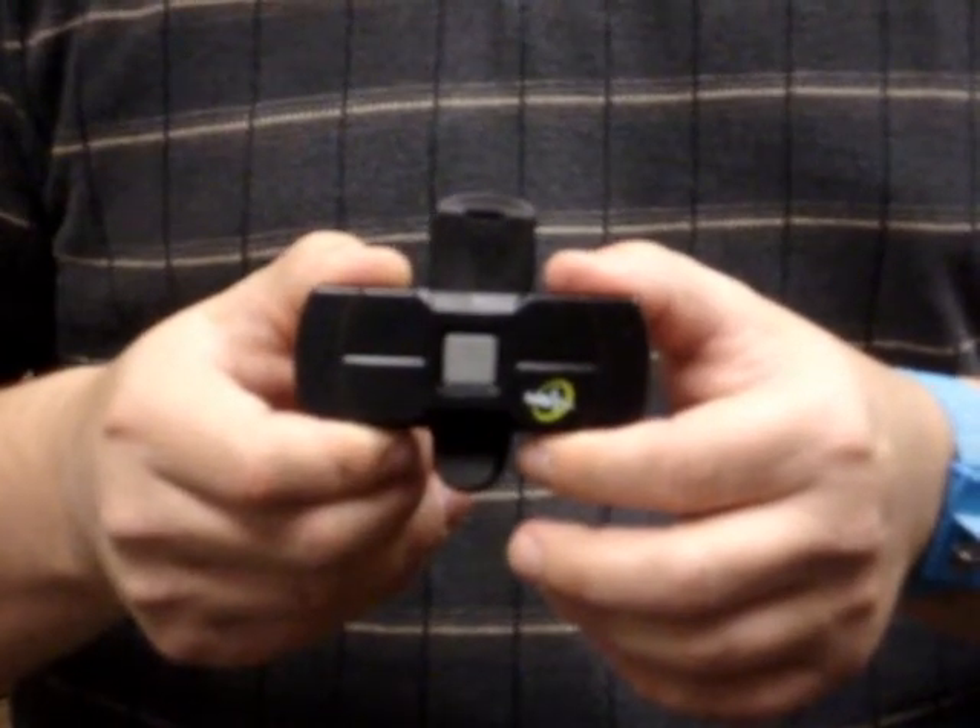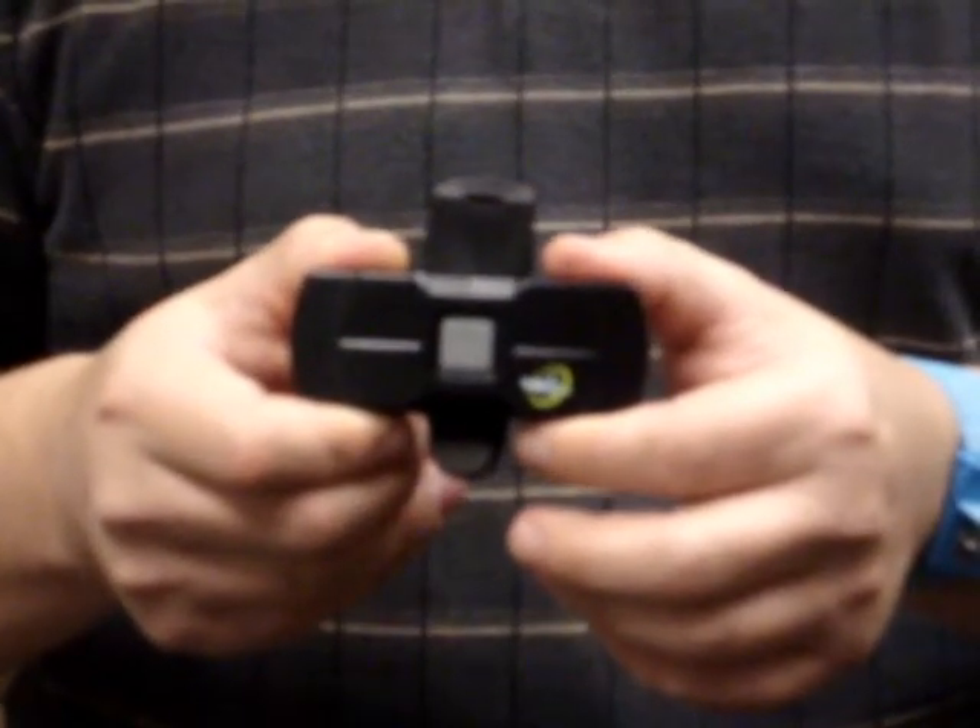Hi, my name is Chris Morris from Halo Monitoring. I'm going to show you how to properly wear the new My Halo clip. It is very easy to use. You just clip it onto your belt, pants, or skirt.